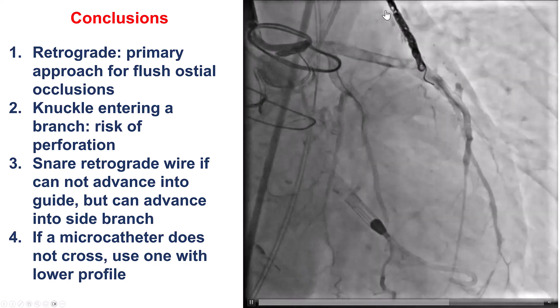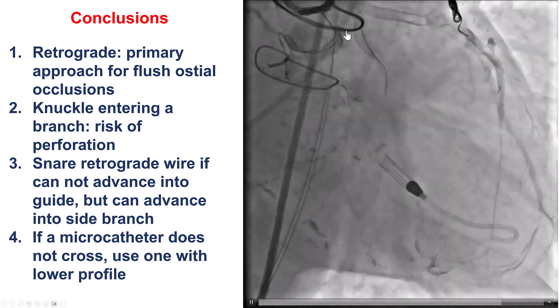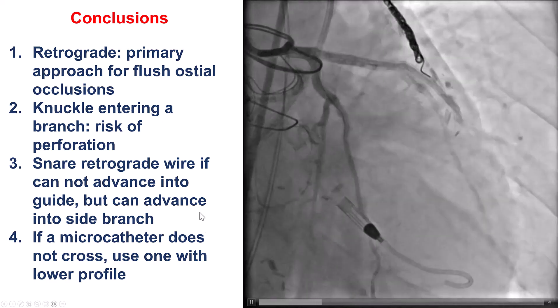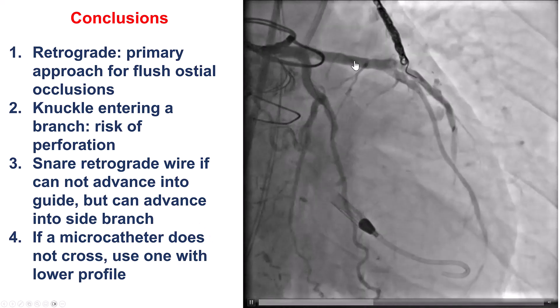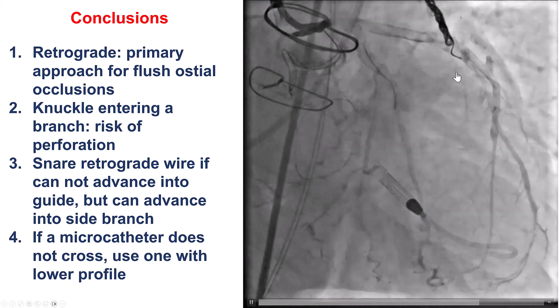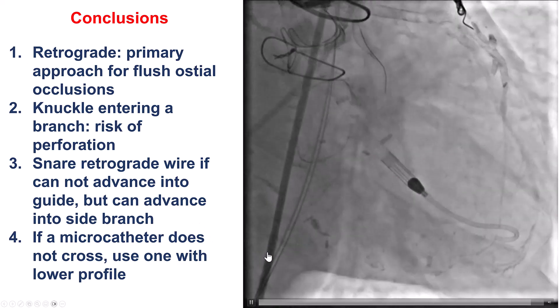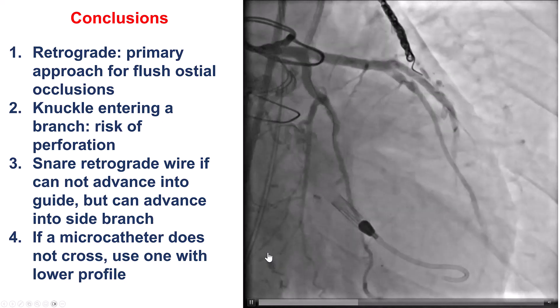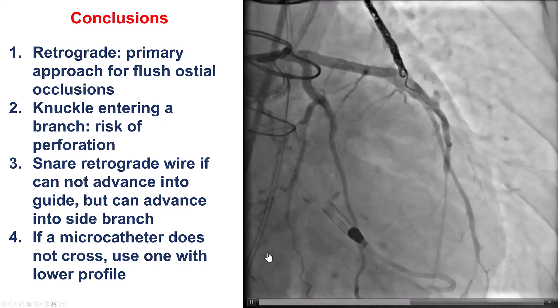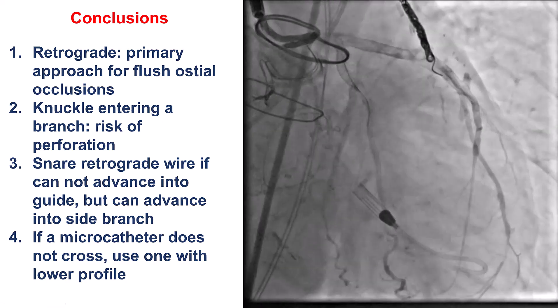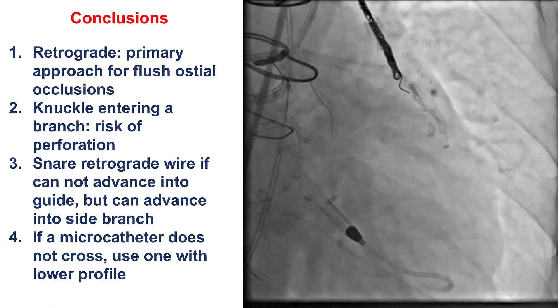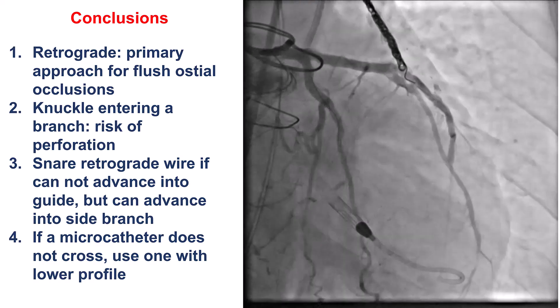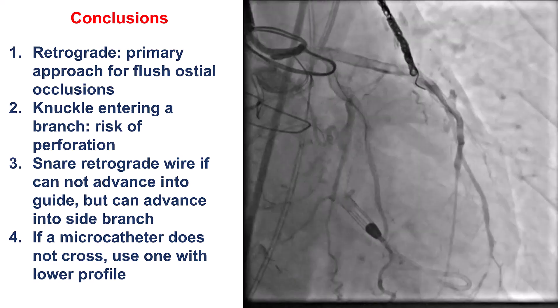Finally, when there is difficulty crossing with a retrograde microcatheter, one solution is to advance a different microcatheter. The FineCross M3 used in this case seems to be very promising, with a very low profile and excellent crossing capacities. Thank you.